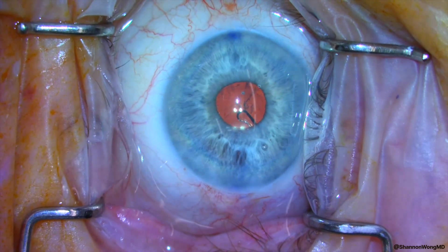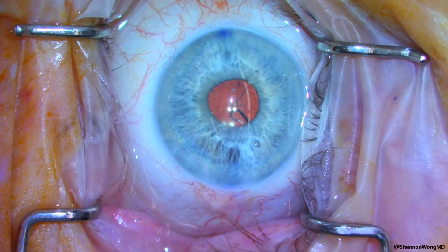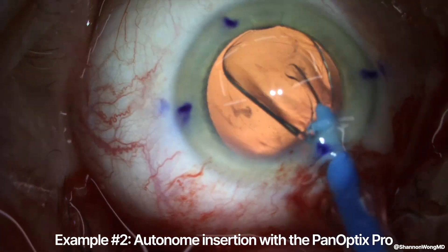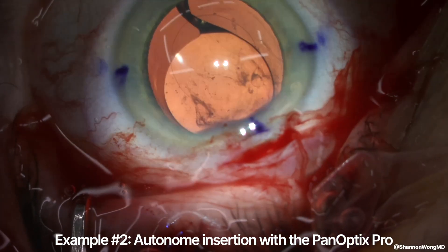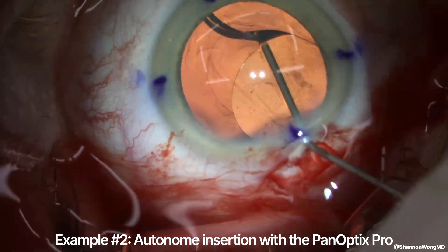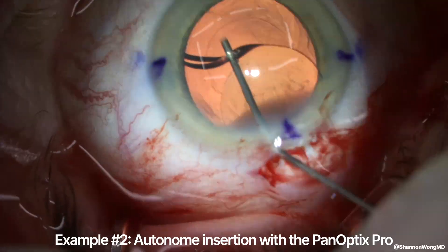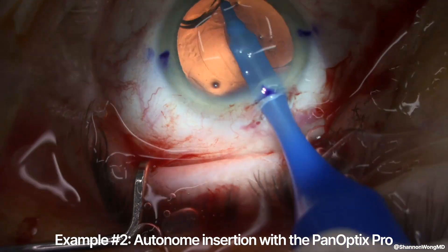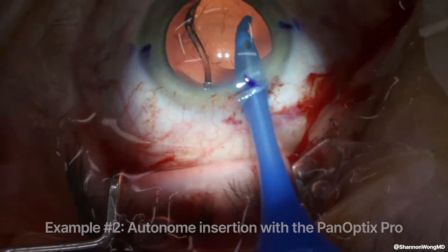Let's look at how the autonomy delivers the Panoptix Pro on four other cases. Here on case number two, the Panoptix Pro again comes out in a backward-esque configuration, leaving the leading haptic in the incorrect position, and it has to be maneuvered to place it into the correct position, which is an unnecessary step in my opinion.